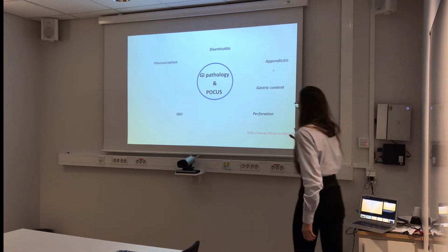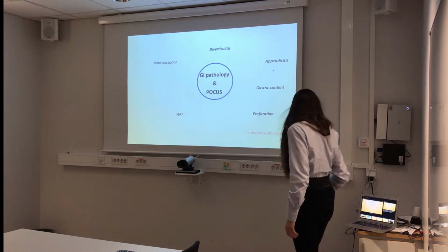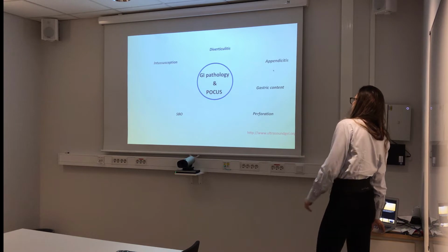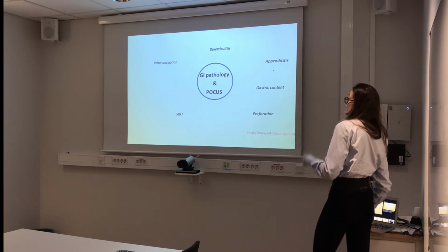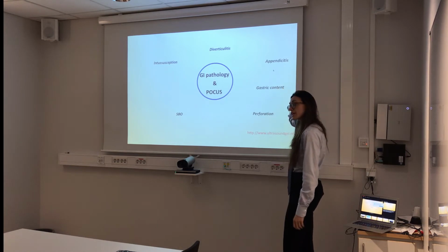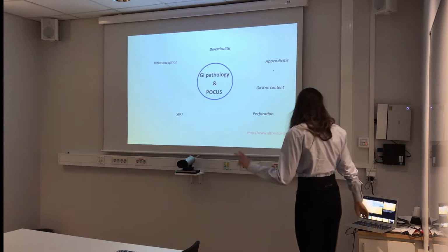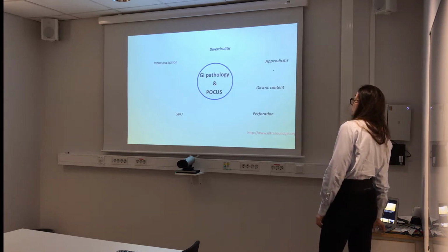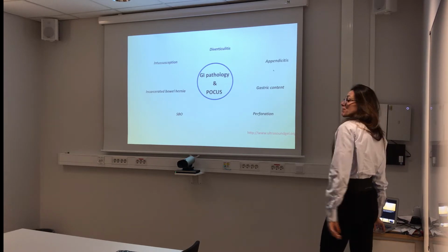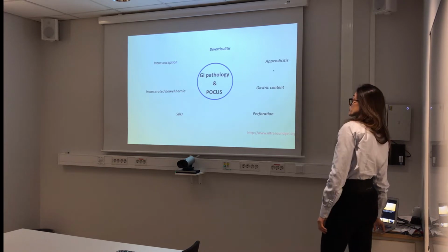In terms of perforation, you cannot rule it out, but you can see free air in the abdomen. We will see later on because it's one of the complications of the SBO. Then the gastric content. Two new articles went up on the ultrasound gel podcast regarding the gastric content. There are two new studies. I can even run a point of care ultrasound journal club on it if there is interest. Incarcerated bowel hernia is sometimes related to the small bowel obstruction.